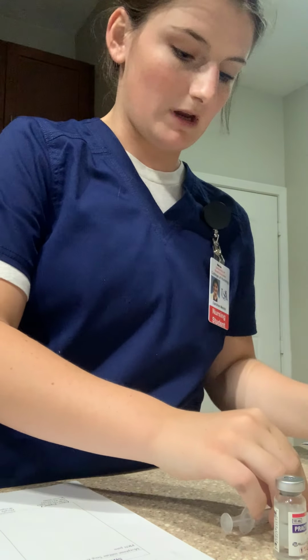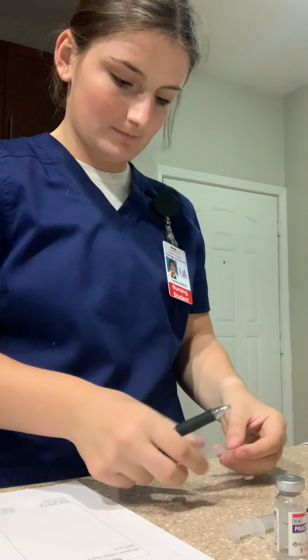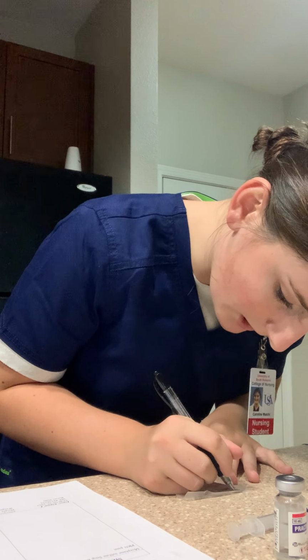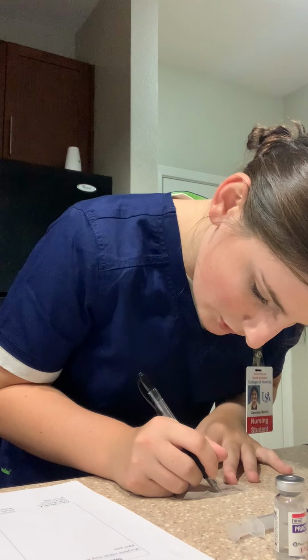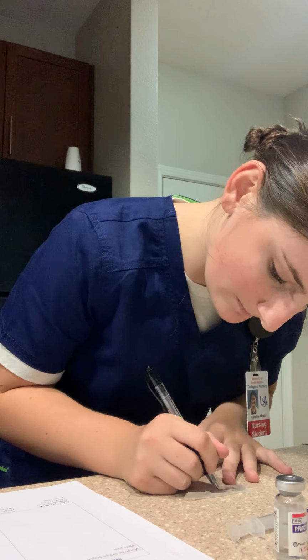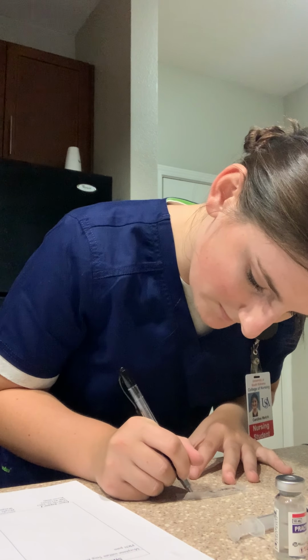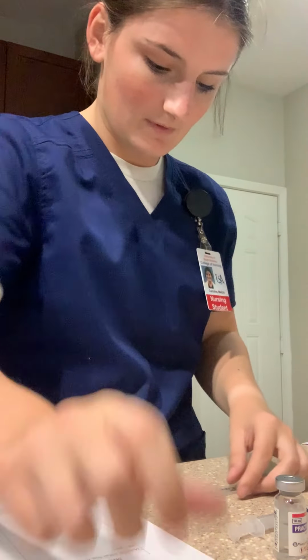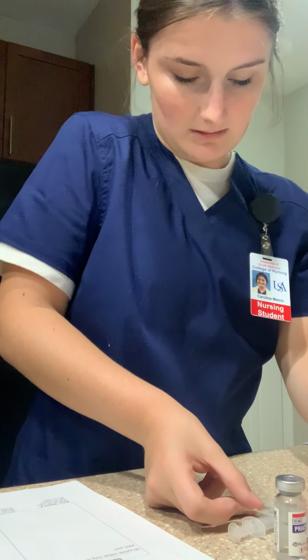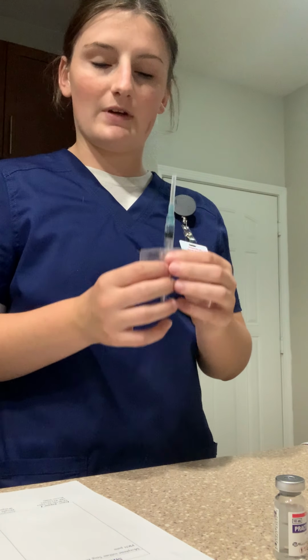I'm going to create a label. I'm going to put the patient's name, Jaguar Jones, the drug, which is morphine sulfate, and the dose, which is 5 milligrams. So I'm going to place that on my syringe, and then I would ask another nurse to verify this.